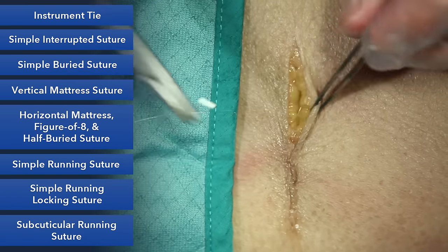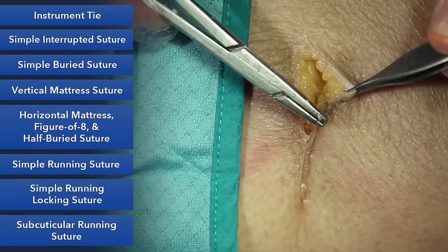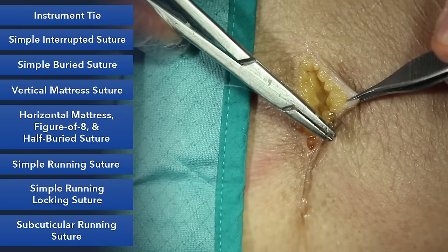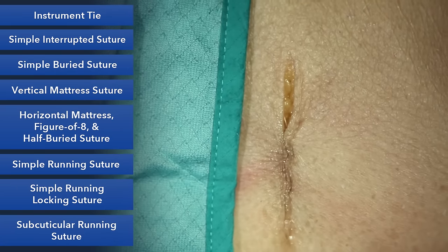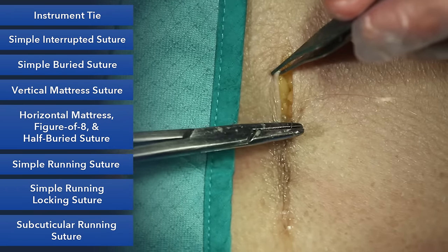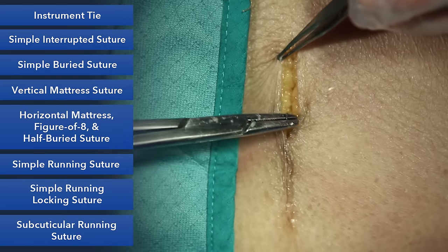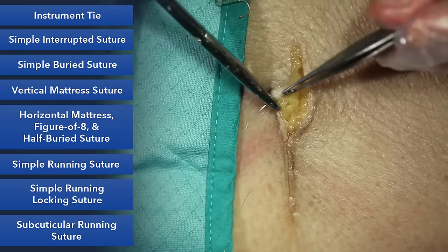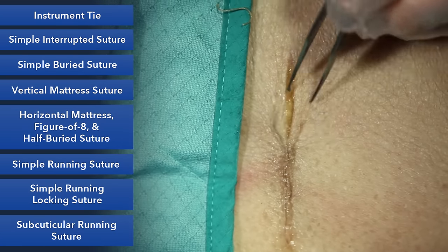To come right there. Can get a good bite of the dermis. Wants to come right there.